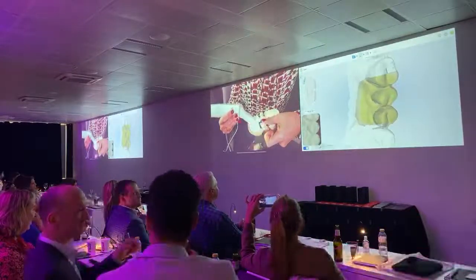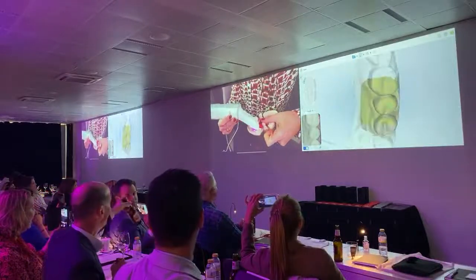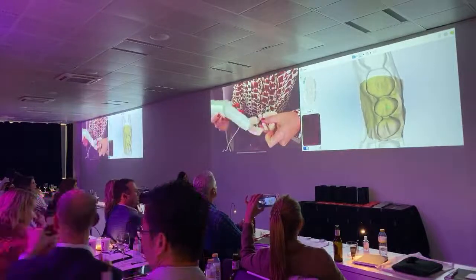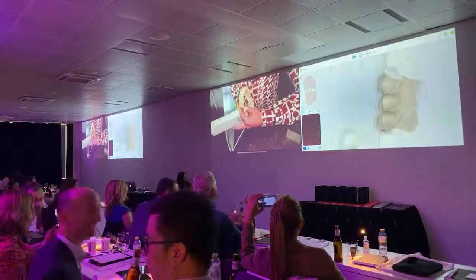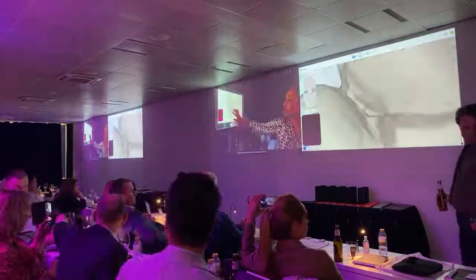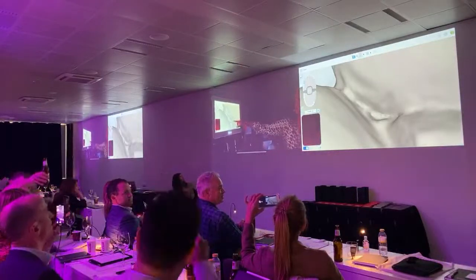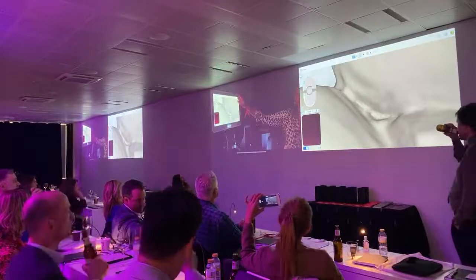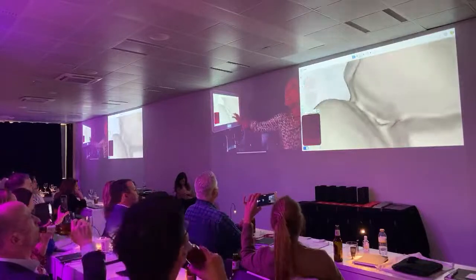And then I go to palatal, and then interproximal, and then I will analyze my scanning. You see those triangles like this? This is not good. If this happens in my prep area or the finishing line of the prep, you have to scan better in these areas.